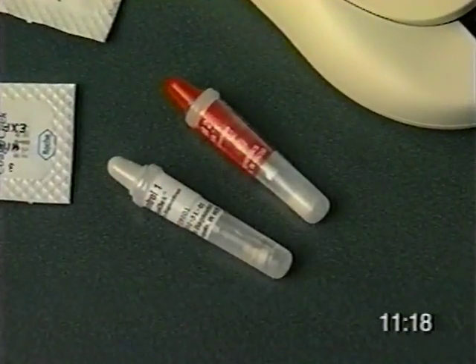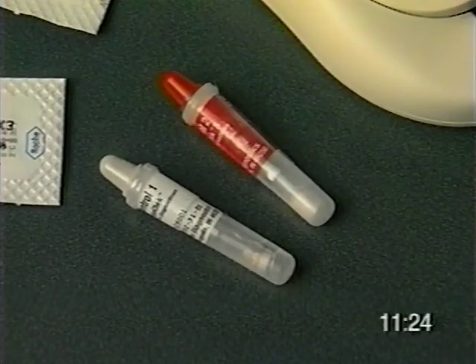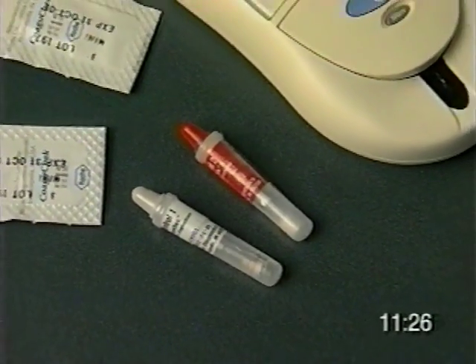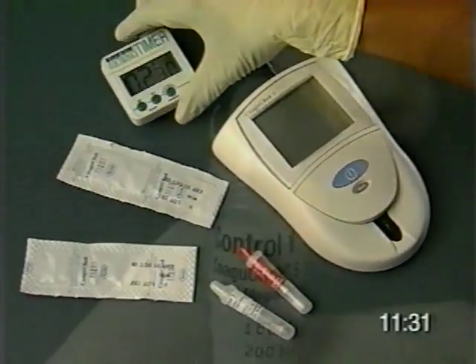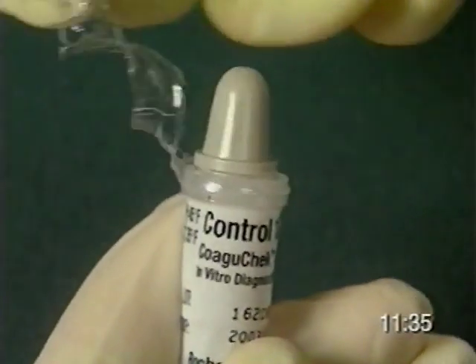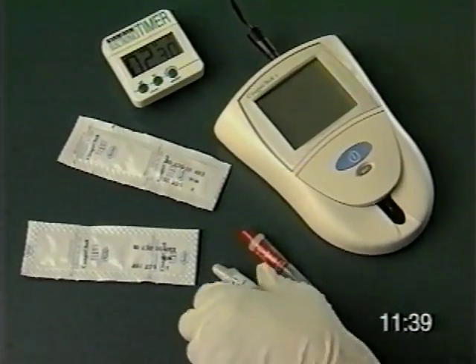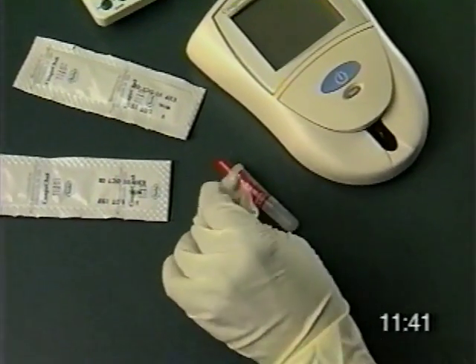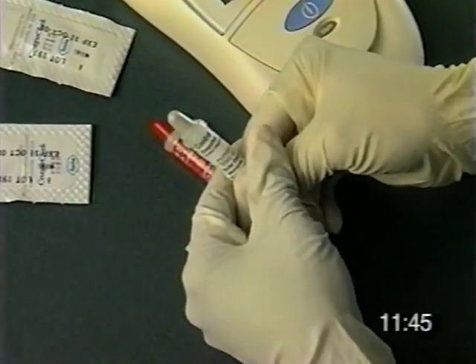There are 2 levels of liquid controls, a Level 1 vial with a gray cap and a Level 2 vial with a red cap. To run the liquid controls, I also need a timer. Take the Level 1 quality control vial and remove the seal. Tap the control vial on a tabletop to move the glass capsule to the bottom of the vial. Squeeze the vial to break the glass capsule.